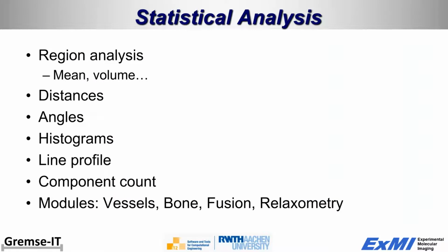Then when you have defined your regions, you can perform statistical analysis, like the mean, the volume, min-max values, or the standard deviation of your regions. Or you can compute distances, like the length of a bone or the size of a tumor. You can measure angles. You can extract histograms of intensities, generate line profiles, or count the number of components, for example these little calcifications. And we have several modules for vascular analysis, bone analysis, image fusion, and relaxometry.